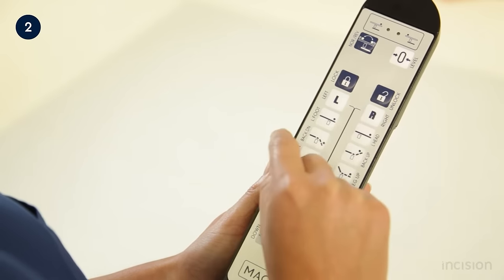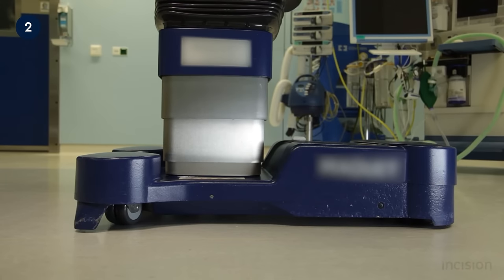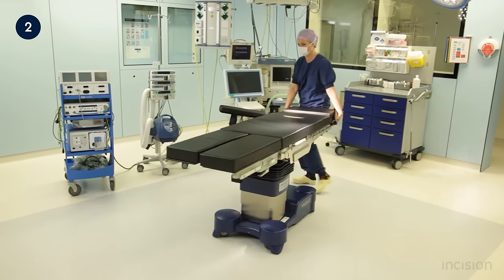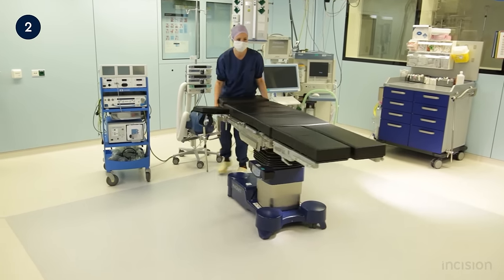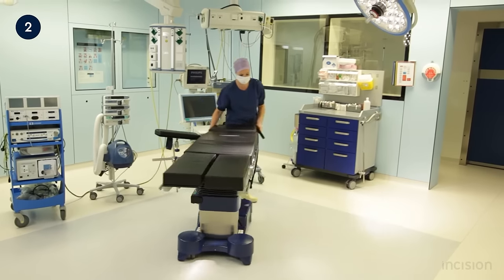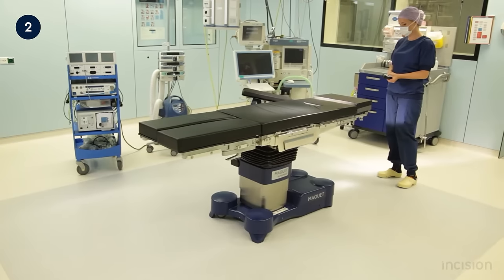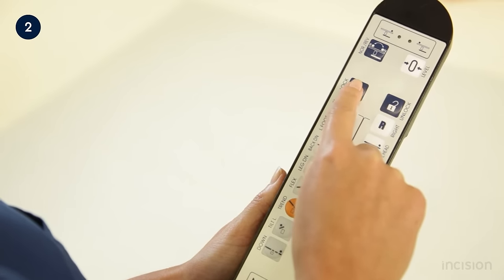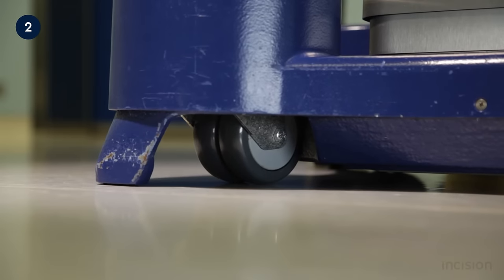Pushing the unlock button releases the brake at the base of the table and allows for the table to be moved into the appropriate position for the surgery to be performed. The table can move freely as now shown. Once in the correct position, the table wheels can be locked. To avoid injuries to staff and the patient, this should be done each time the table is moved.